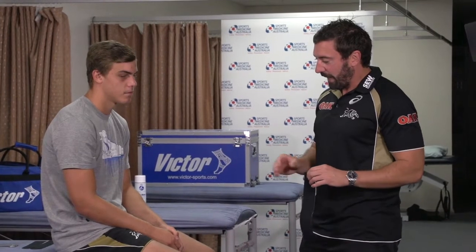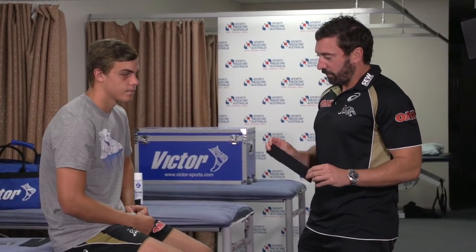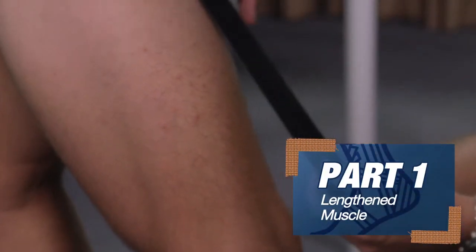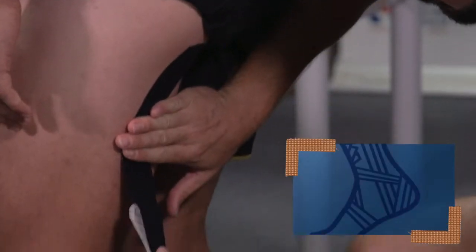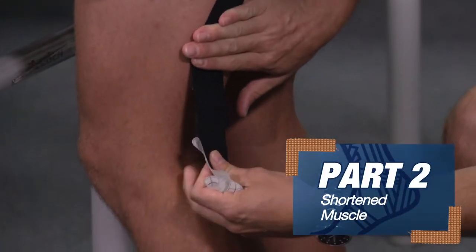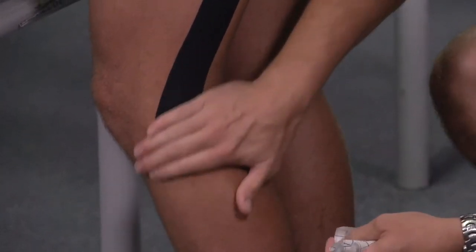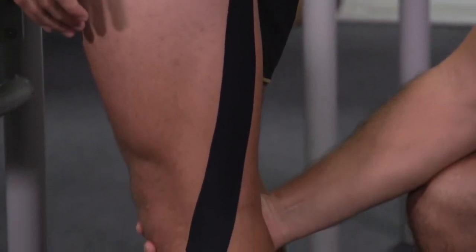I'm going to focus on the hamstring and show you two different procedures on how to use it on a lengthened muscle, which we would use if we're dealing with, say, muscle tightness. And we'll also go through how to apply it to a shortened muscle, which we might use on a weak muscle, just to get that recoil effect, which is the more traditional type of taping on a shortened muscle.